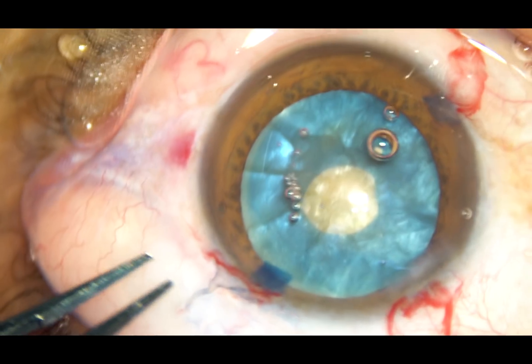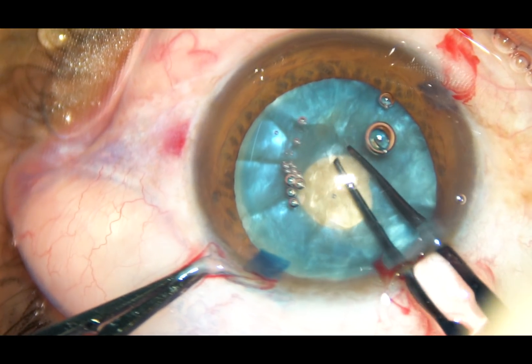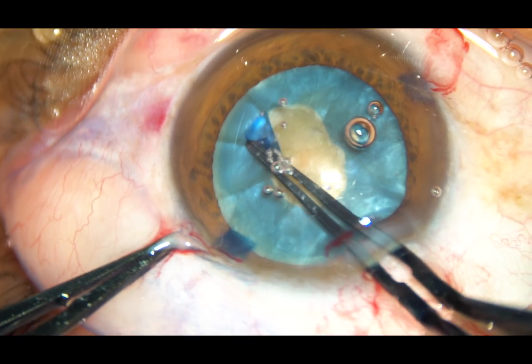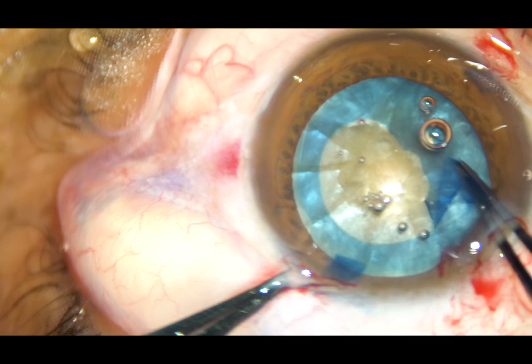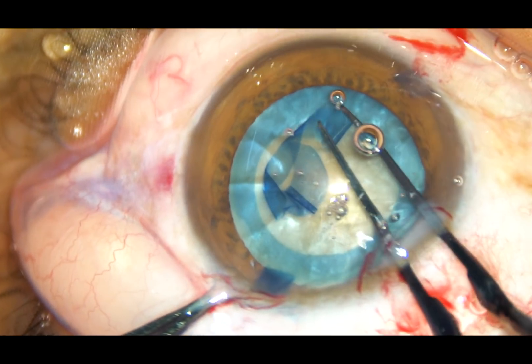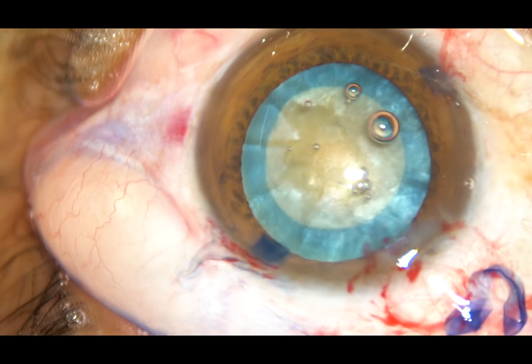A small nick is made at the margin of the rhexis. The tag is held with the Utrata forceps again. And now the mini rhexis is enlarged into an optimum sized rhexis of, say, 5.25 millimetres. The rhexis is completed.